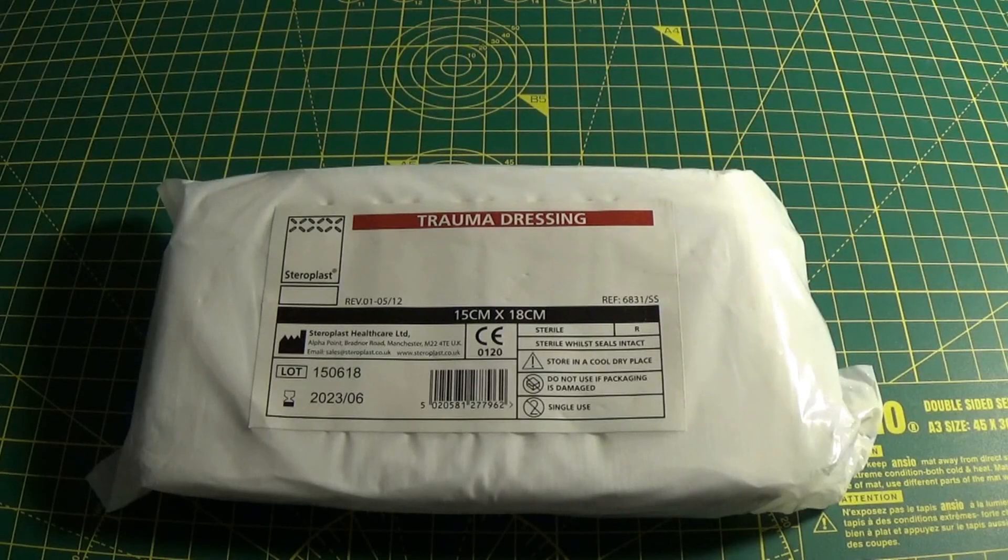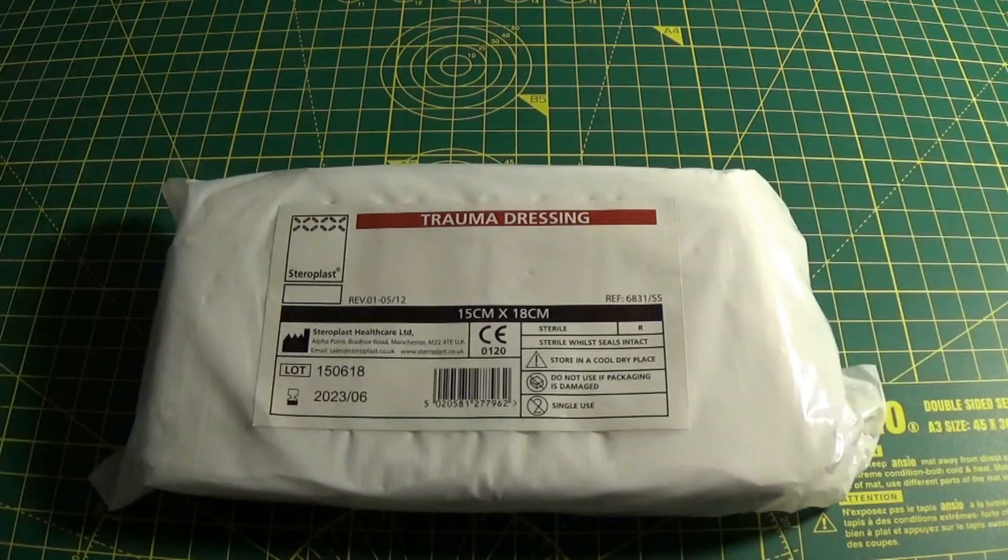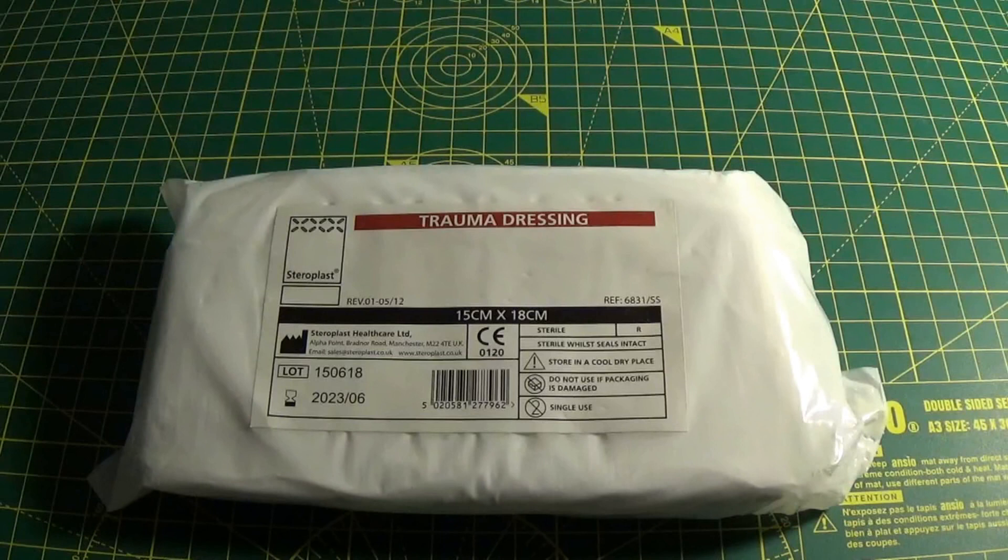Hi everybody and welcome to the Epic Medic Channel. Today I want to give you an overview of this — a Steroplast trauma dressing. Really awesome bit of kit which costs less than £5 from a number of different retailers and can really make a difference in a life-threatening or non-life-threatening bleed situation.